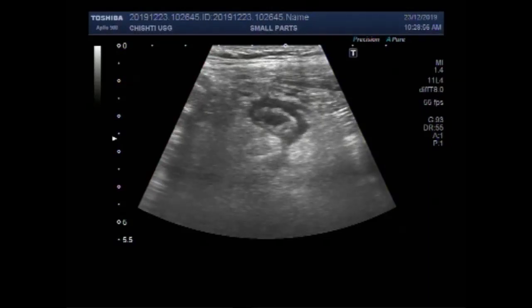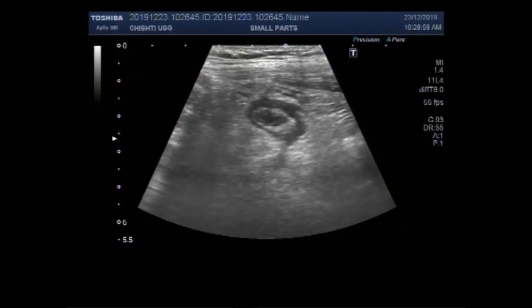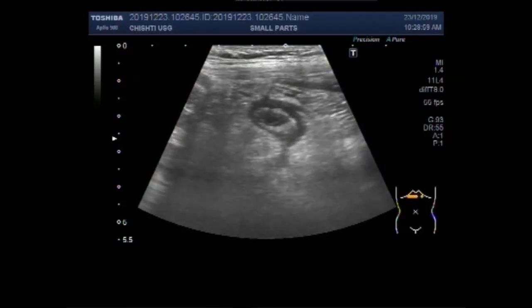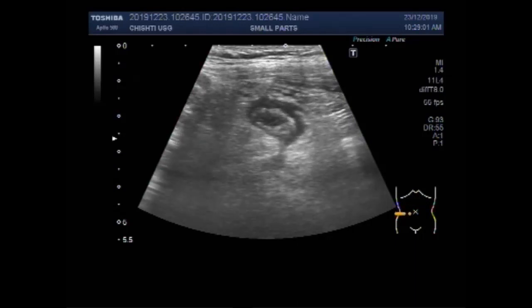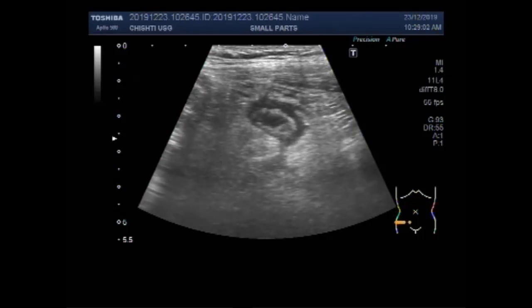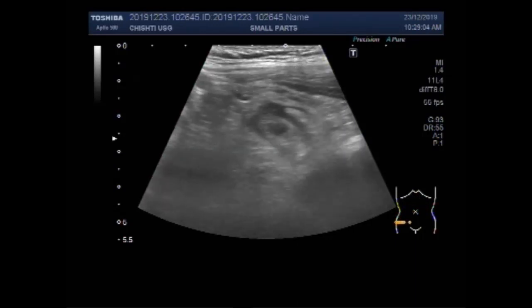Dear viewers, I hope you are all fine. This ultrasound video shows the focusing of the acute appendicitis.